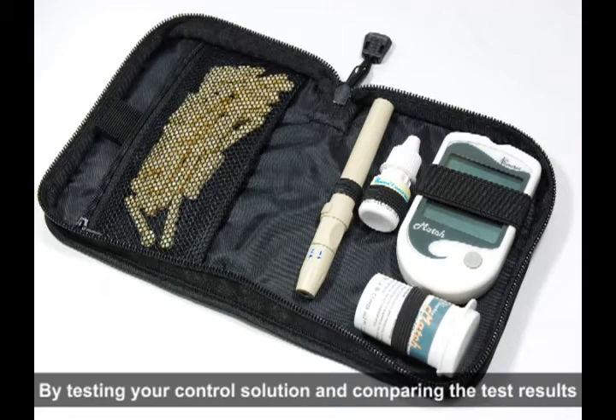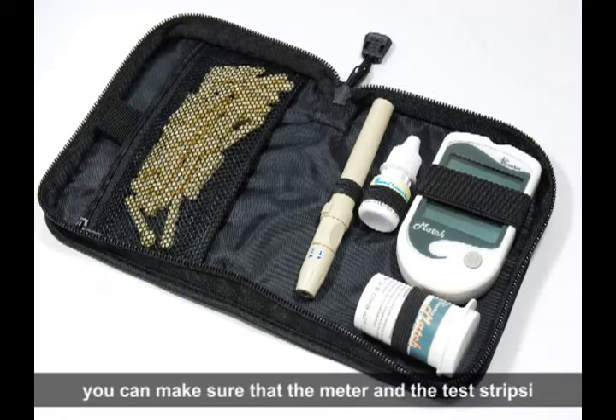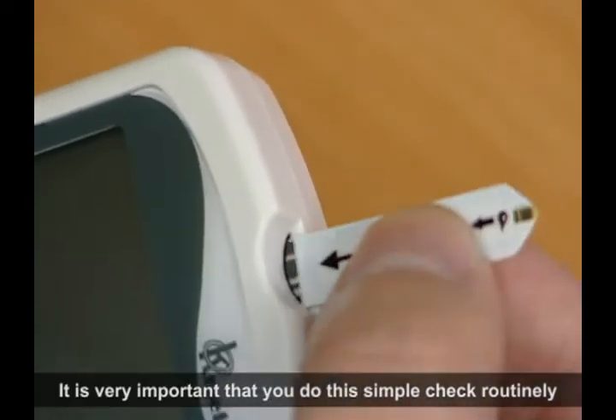By testing your control solution and comparing the test result with the expected range printed on the test strip vial label, you can make sure that the meter and the test strips are working properly together as a system and that you are performing the test correctly. It is very important that you do this simple check routinely to make sure you get accurate results.